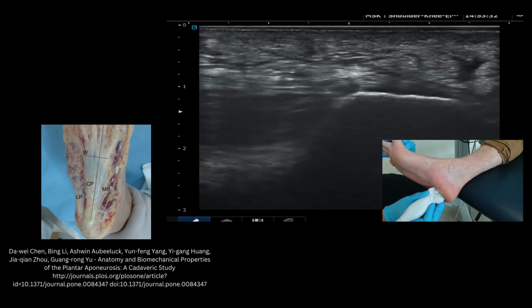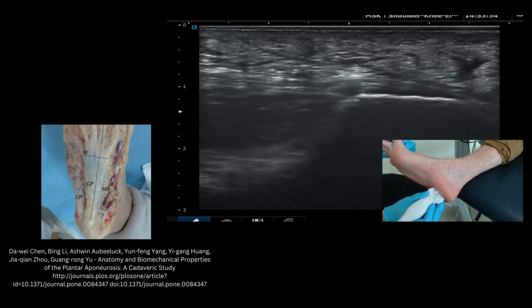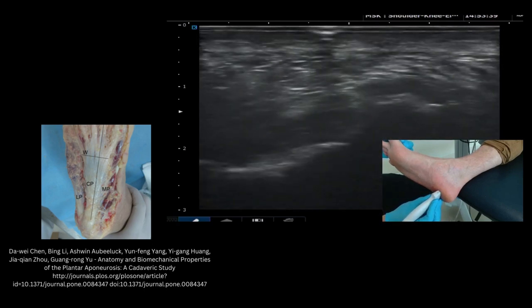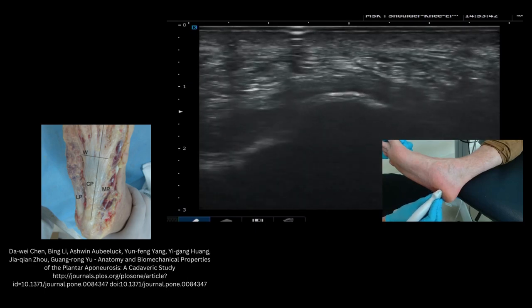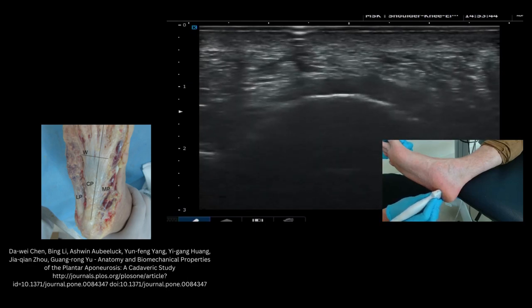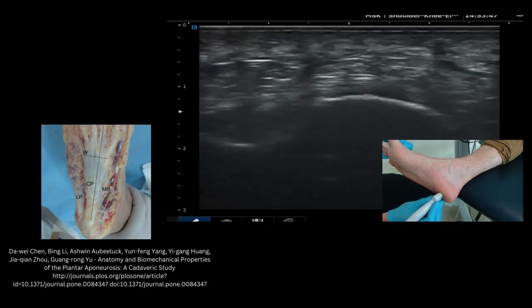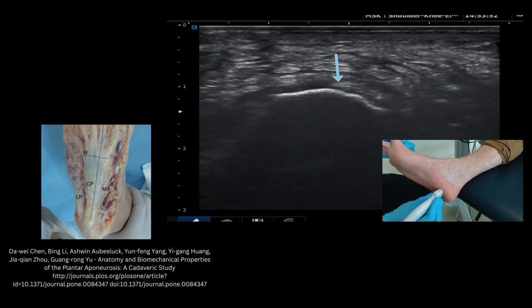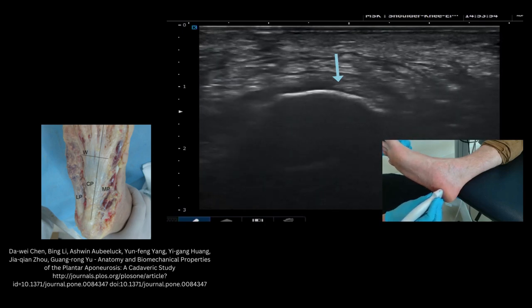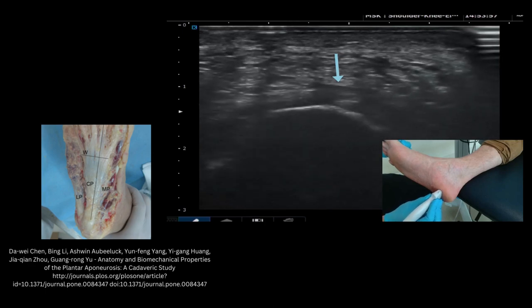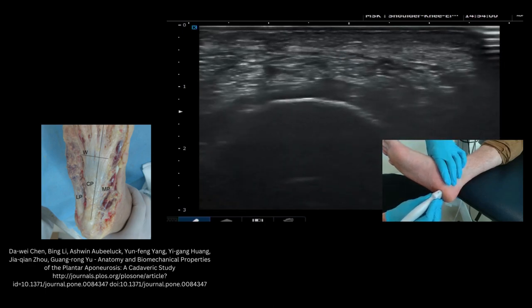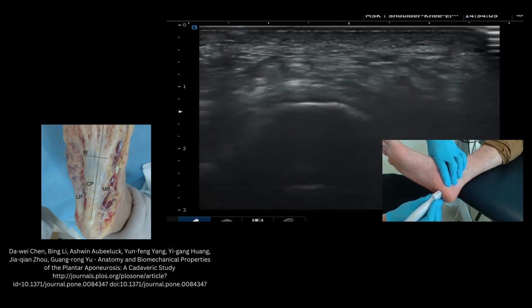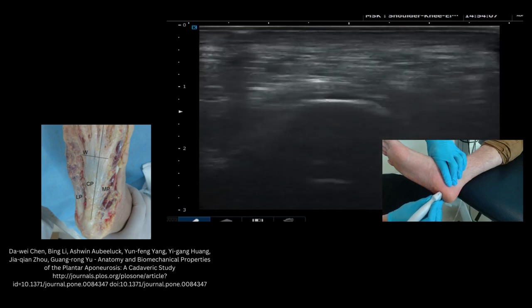Again, we can look at this dynamically with the windlass mechanism — first MTP joint extension dynamically tensions the structure up. Now we can go into short axis, which is a little bit trickier in some ways to see. Again highlighting the calcaneus, and on top of it you'll see the plantar fascia. Using a nice probe angle to try and isolate it, you can also palpate the subcutaneous fat layer to create a little interface to help see the difference between tissue layers — between the fat pad and the plantar fascia itself — which can be quite useful.